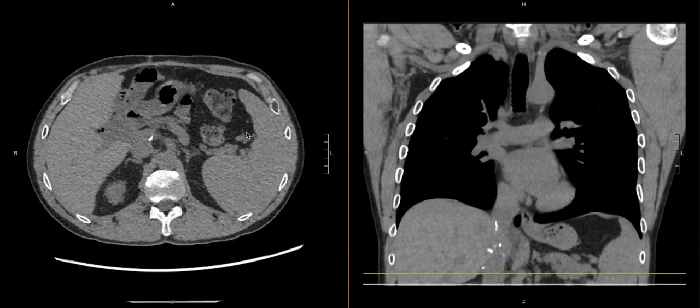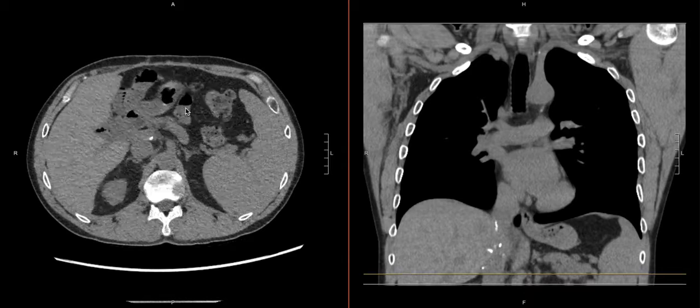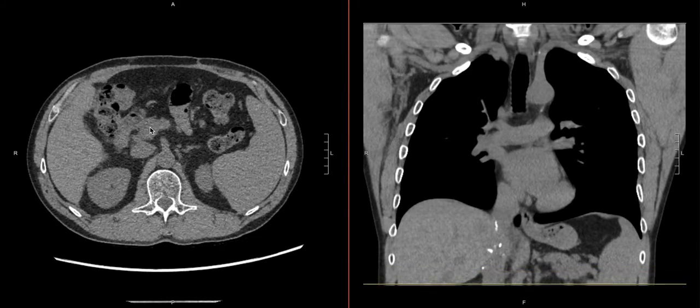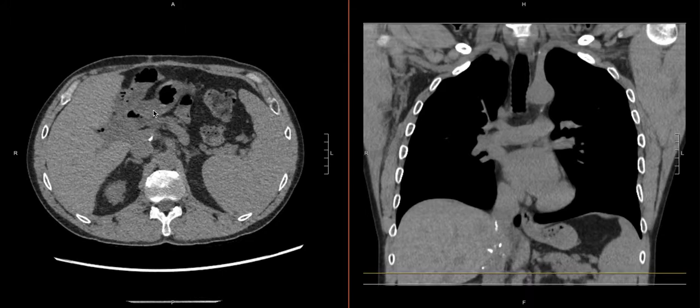And then depending on how low you go, you may catch some or maybe not that much of the upper GI tract past the stomach. So here, maybe we have a little bit of duo here, but we kind of lose it after that point because it doesn't scan low enough.